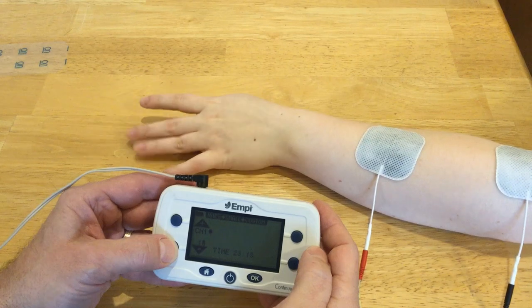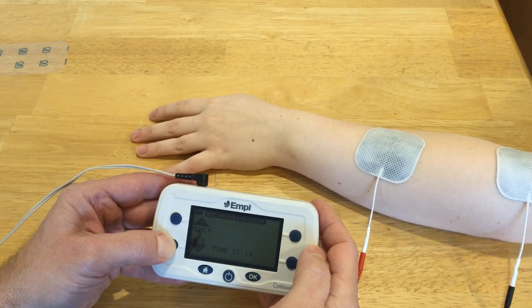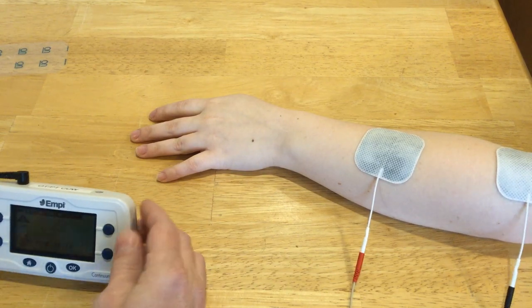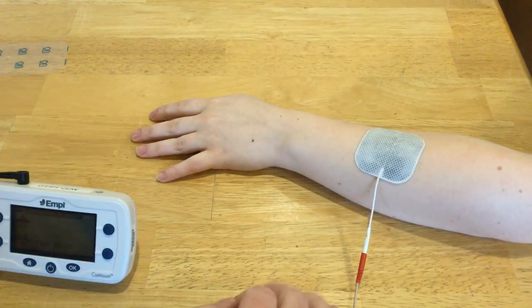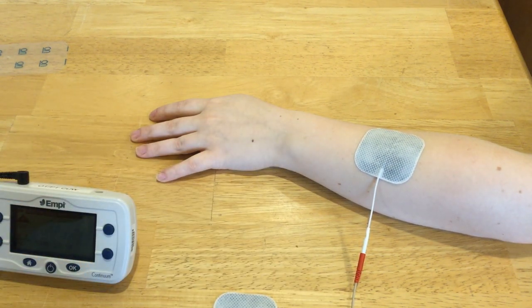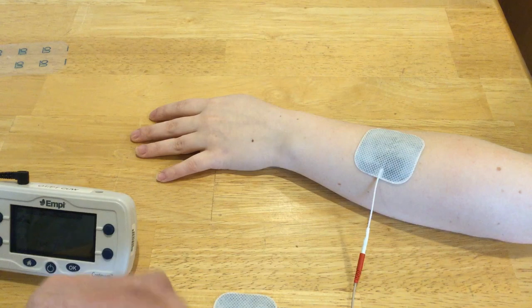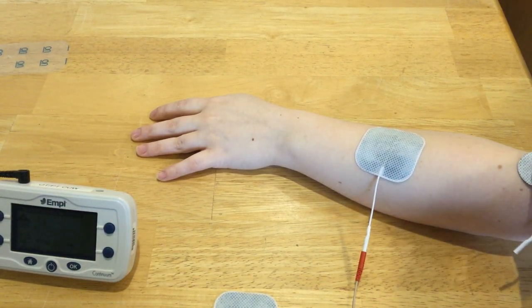So I'm going to turn this down and demonstrate this with a smaller electrode. I'm going to take this one off and put a one-inch electrode right about where I think I need it.